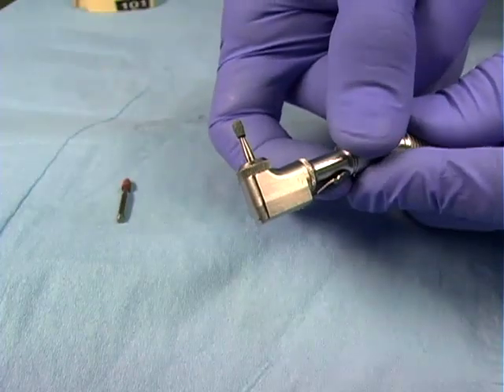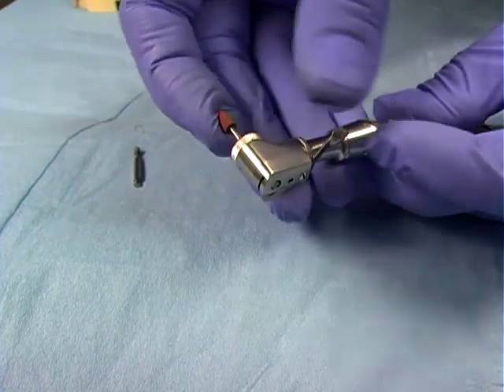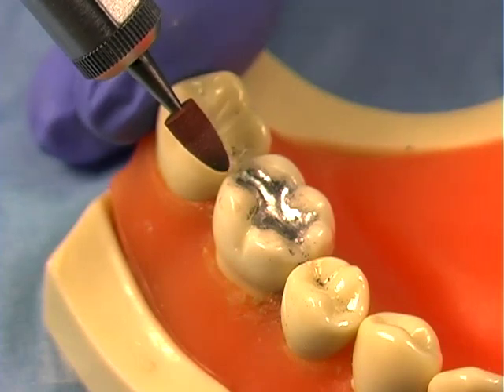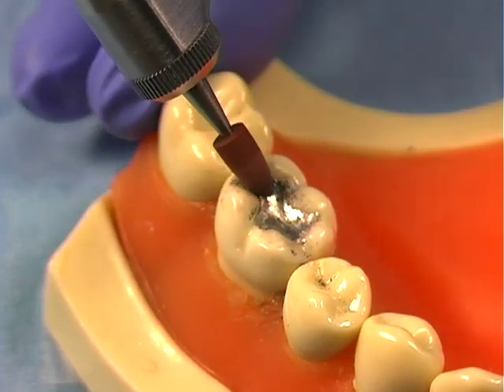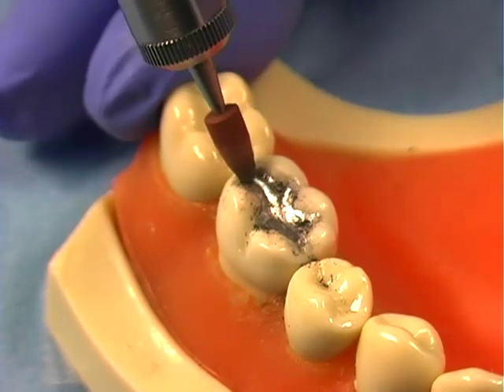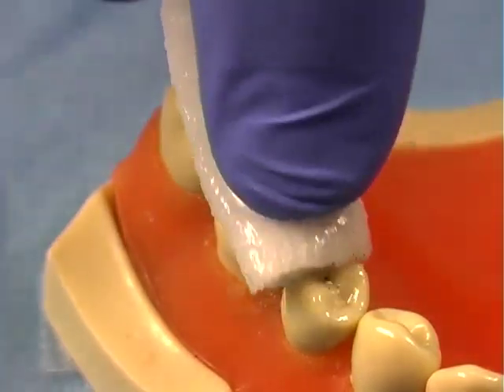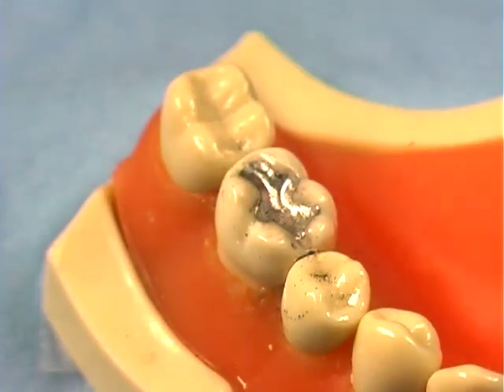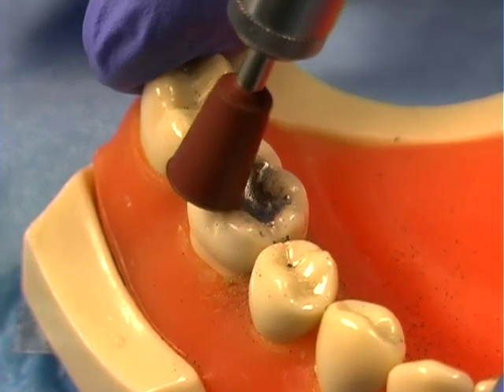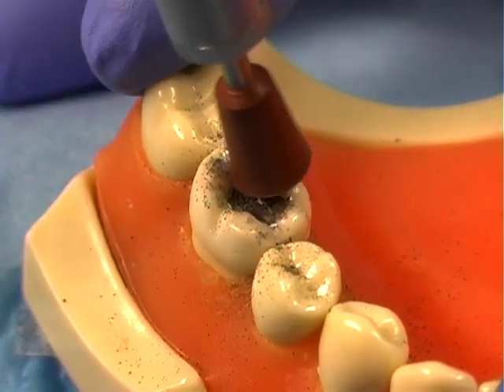Remove the green stone and insert the brownie point. Apply moderate pressure with the brownie point to polish the grooves on the occlusal surface. Rinse the surface to cool and to clean — on a patient, this would be done with the water syringe. Use the brownie cup to polish the cusps and interproximal surfaces, flaring the edge of the cup on the cusps and interproximally if needed.